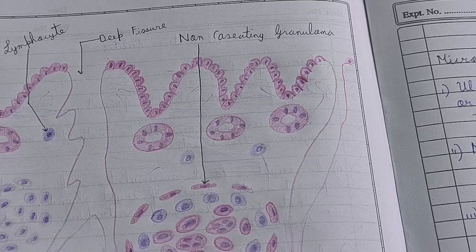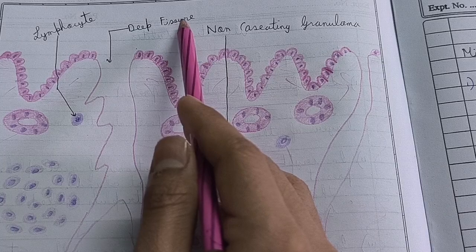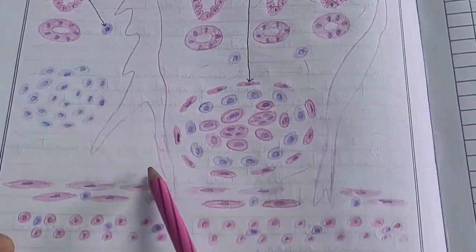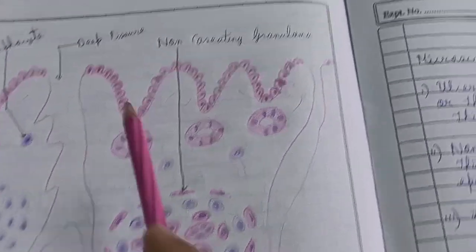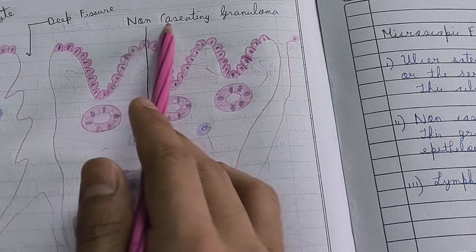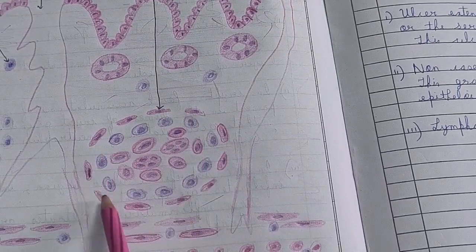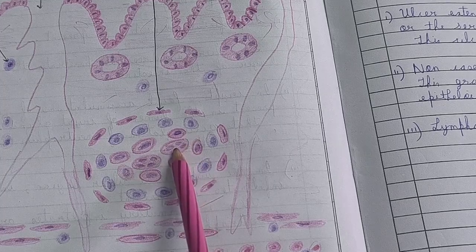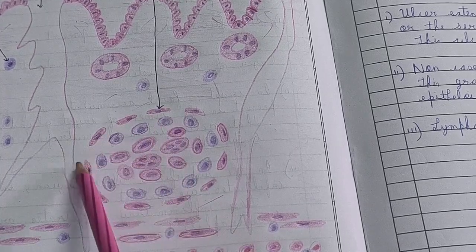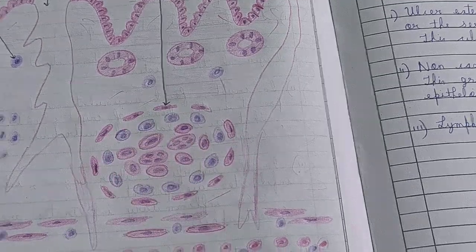So what are the microscopic features found here? The first one is the deep fissure, which is the ulcer converted into a deep fissure when it extends up to the serosal layer. The next is a non-caseating granuloma, and the components are giant cells, epithelioid cells, lymphocytes and plasma cells. So this is a non-caseating granuloma.